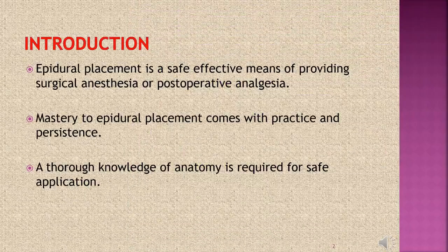Introduction part. Epidural placement is a safe, effective means of providing surgical anesthesia or post-operative analgesia. Mastery of epidural placement comes with practice and persistence. A thorough knowledge of anatomy is required for safe application.